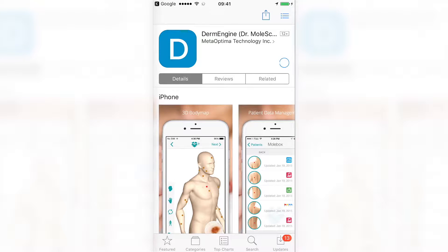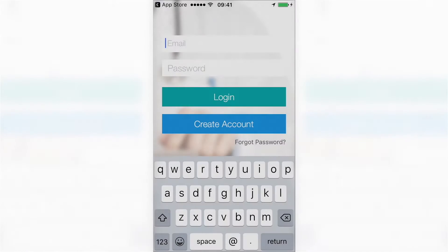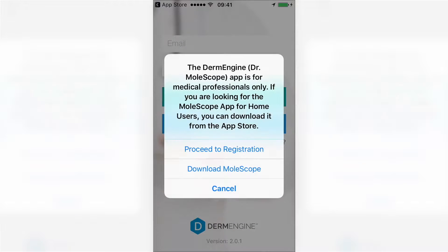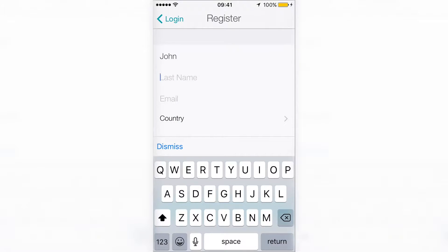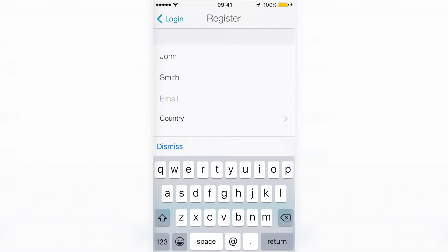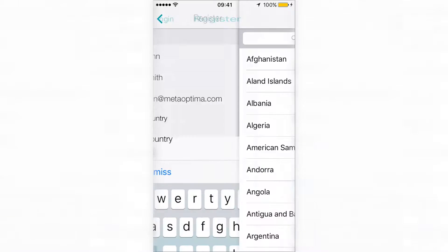Once your download is complete, you can create your DermEngine account if you don't already have one. To register, tap on Create Account. You will be prompted with a message reminding you that DermEngine is for medical professionals only. You can register your account by entering your information such as first and last name, email, and country.